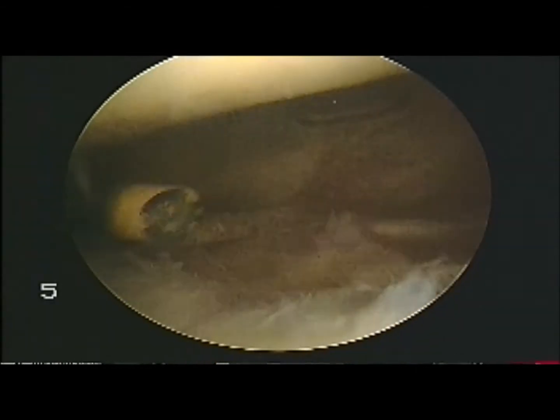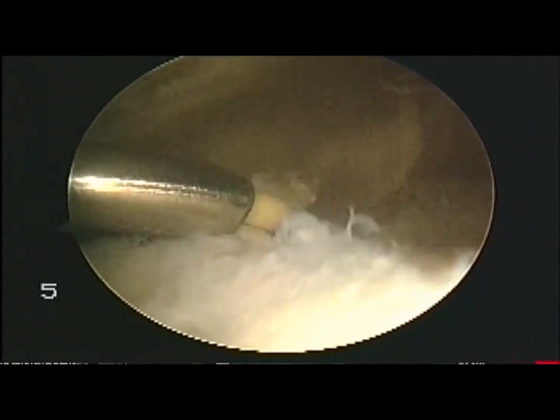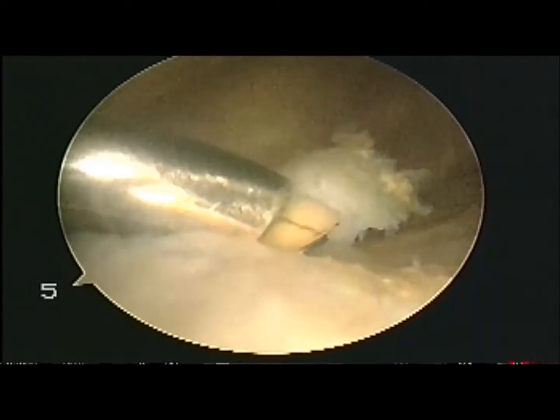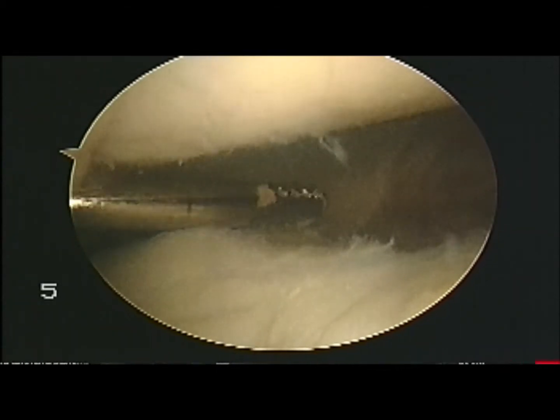So why not use the ArthroCare on its own and not in conjunction with a shaver? Well, the ArthroCare is very safe and good at removing this tissue. It's very good at dividing tissue and sealing vessels. However, it won't deal with large or extremely grisly fragments of tissue.